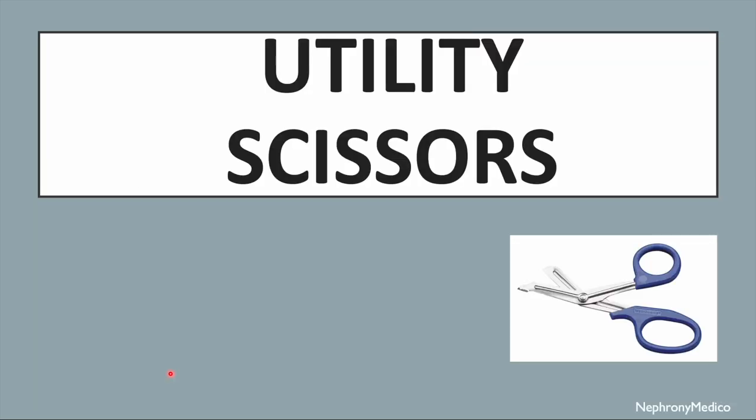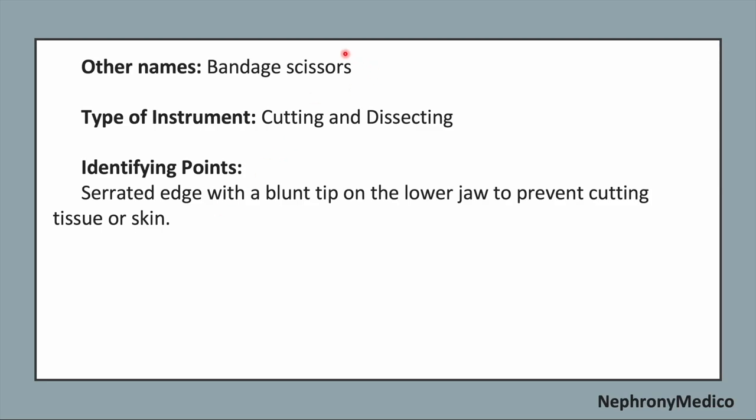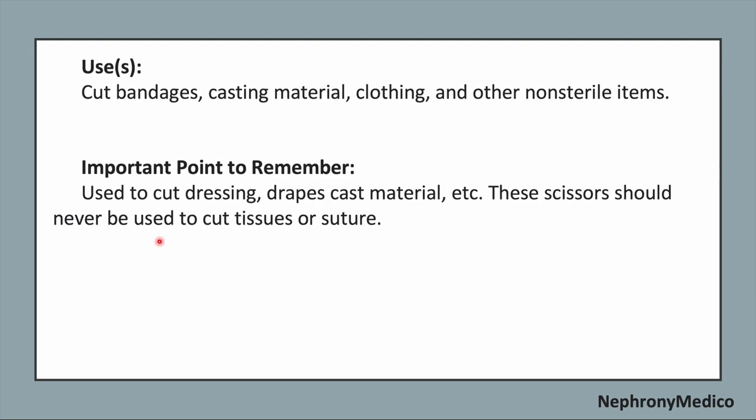Let's talk about utility scissors. This is a picture showing utility scissors. The other name is bandage scissors. It is a cutting and dissecting type of instrument. Now, identifying points. Serrated edge with a blunt tip on the lower jaw to prevent cutting tissue or skin. Use. To cut bandages, casting material, clothing, and other non-sterile items. Important point to remember. It is used to cut dressing, drapes, cast material, etc. These scissors should never be used to cut tissues or suture.